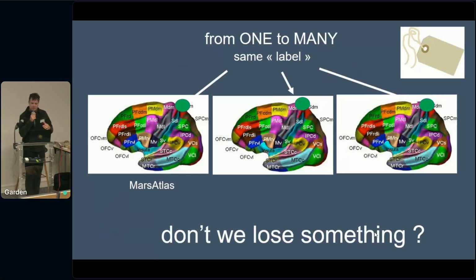And right now the approach is using parcellation and atlases. So you would say, okay, this electrode is in that particular area, and in that other patient also, and in that other patient also, and so on. So I put them together, and then I do statistics.